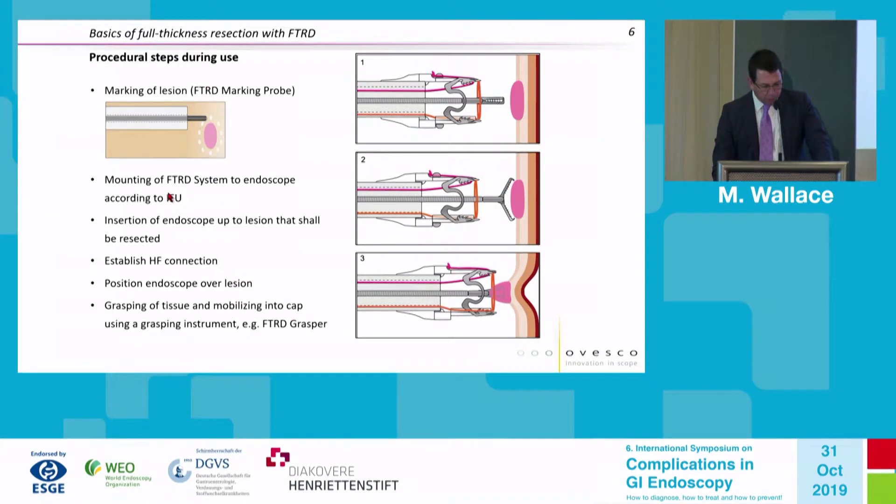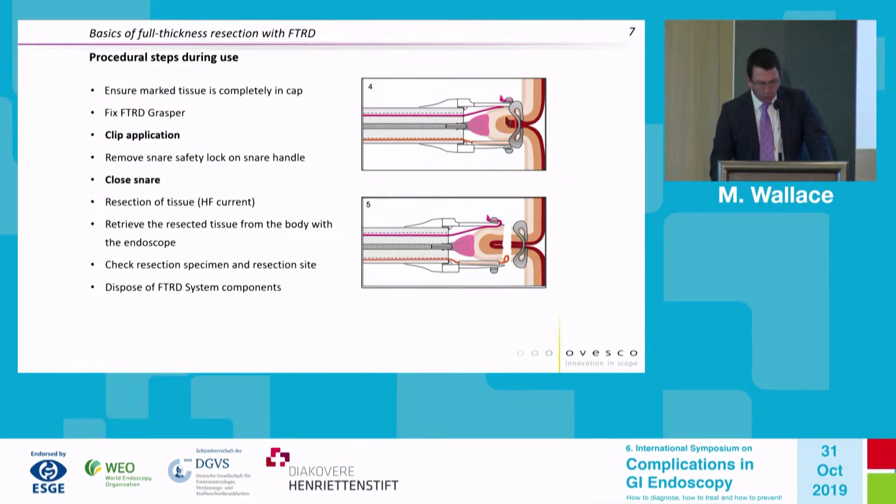The device is mounted on the endoscope using the instructions for use. The endoscope is carefully advanced back into the lumen, and the electrosurgical unit is attached. The lesion is positioned over the cap and grasped and mobilized into the cap — importantly, without the use of suction. We like to visualize that the marked tissue is completely in the cap; you could see the electrocautery marks, at least some of them, in the video.